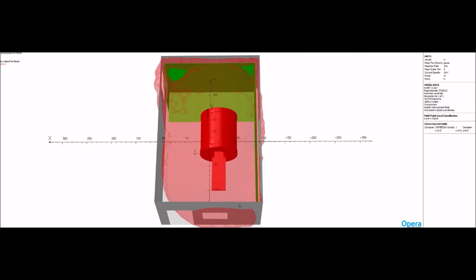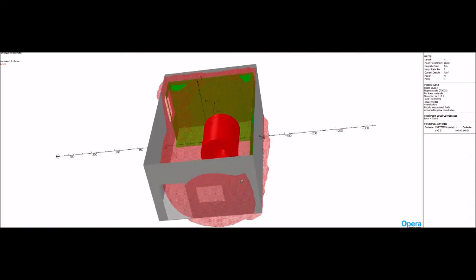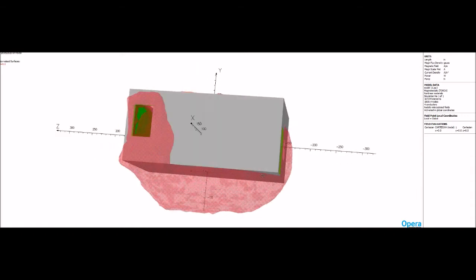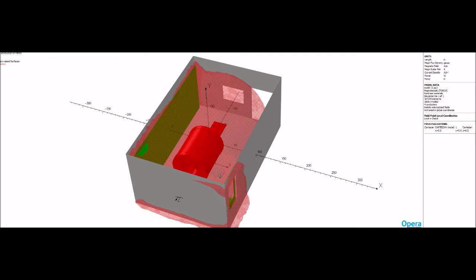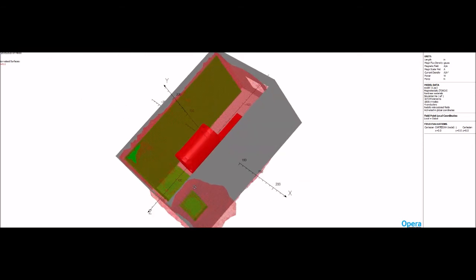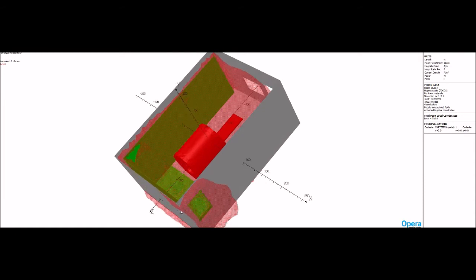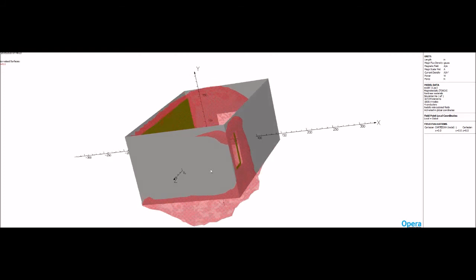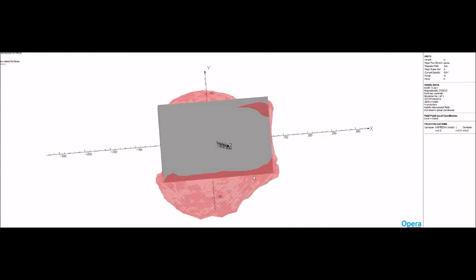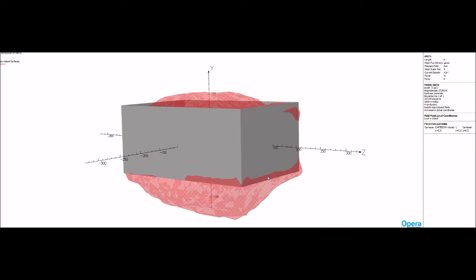This is the final design after adding steel over here where the penetration panel goes. And what that does is it eliminates almost all of the 5 Gauss from leaking out at that corner. It does actually come out maybe an inch or two above 10 feet. It leaks out a little bit there. Also, you'll see towards the bottom there's a little bit of 5 Gauss leakage. That's only a couple inches from the ground, and it only comes out a couple inches from the wall.